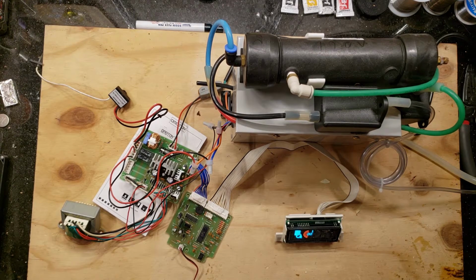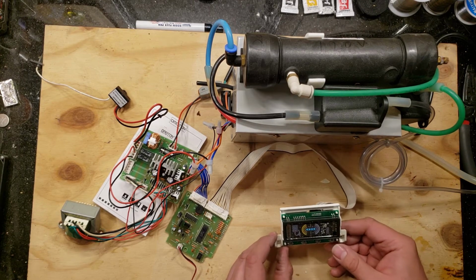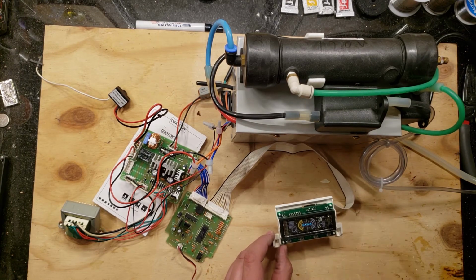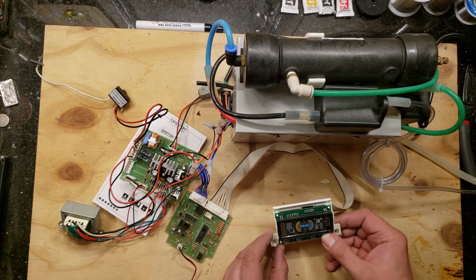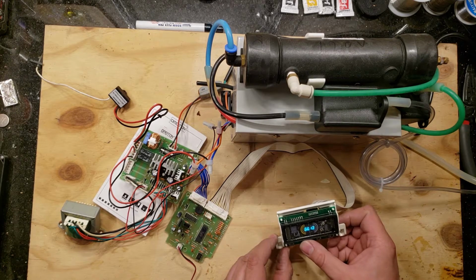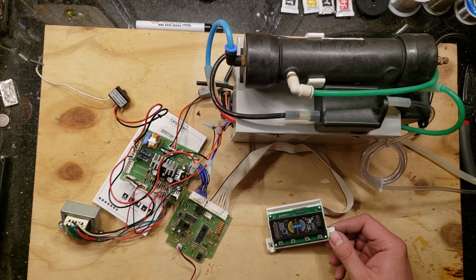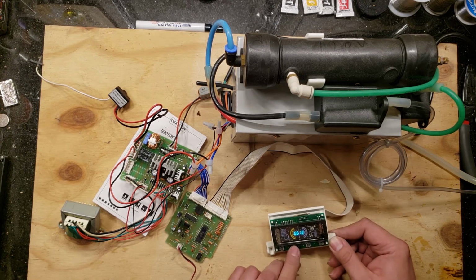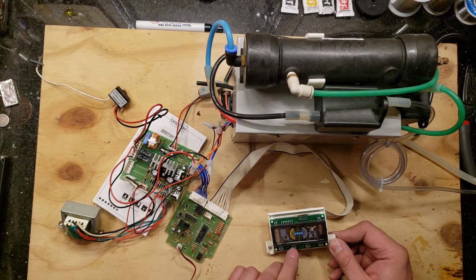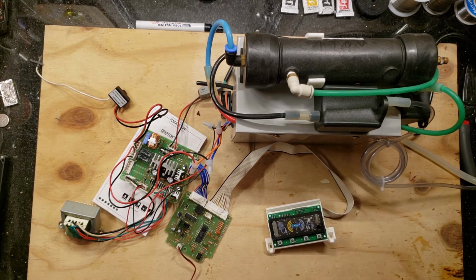No, nothing exploded. Let's try pressing that power button again. Oh, it did something. Oh, actually, no, that was a coincidence that it was done booting. So yeah, the power button doesn't do anything. The timer button shows 6613, so I don't know what that means. And the ion button doesn't do anything. This beeper is awfully loud.